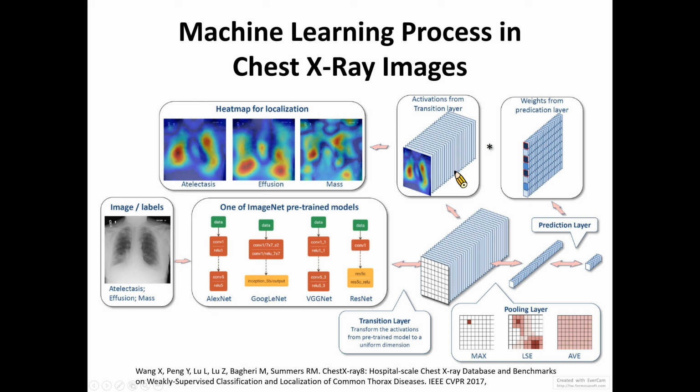So it is still very valuable to use machine learning algorithms to identify pneumonia in COVID-19 cases. And in these papers, they developed an algorithm using pre-trained models, for example, VGG19 and MobileNet, to make binary-class or multi-class classifications of COVID-19 pneumonia and achieved very good sensitivity, specificity, and also accuracy.